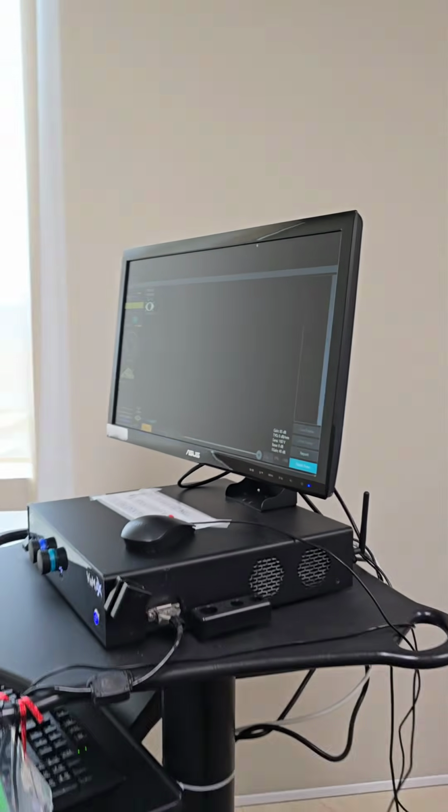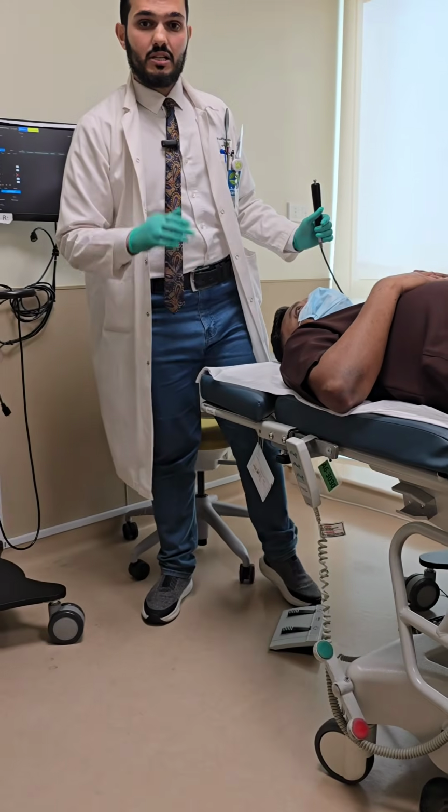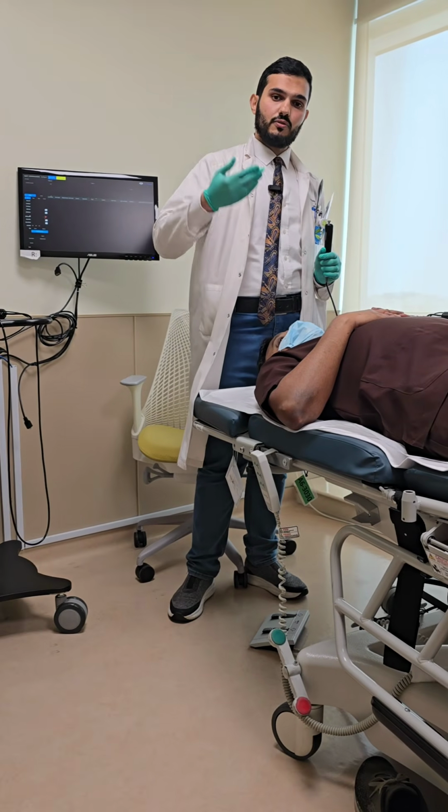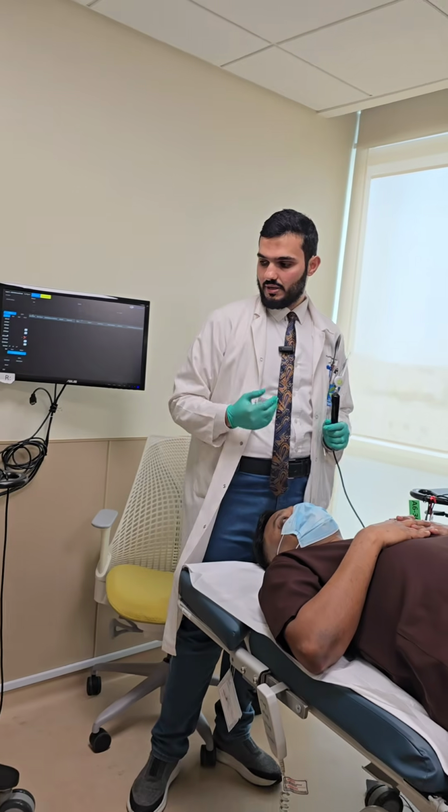And also you have here two pedals. These pedals are to stop and take a screenshot of the cut you want to visualize and send it in the report.